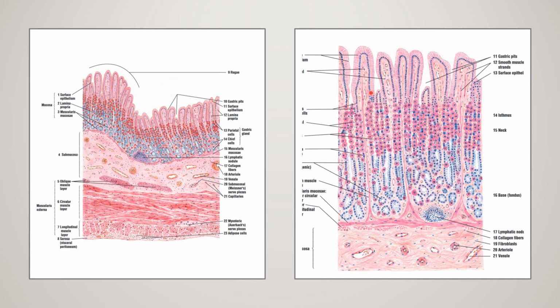As you already know from physiology, we have parietal cells in the stomach that secrete HCl. To protect that, you will be having thick mucus secretion from the cells.